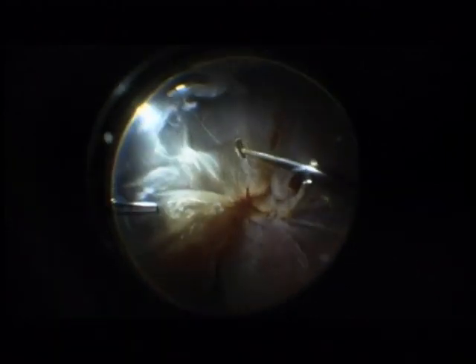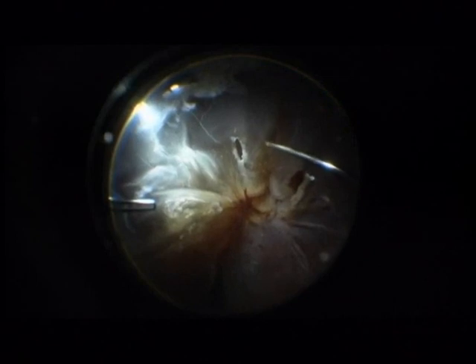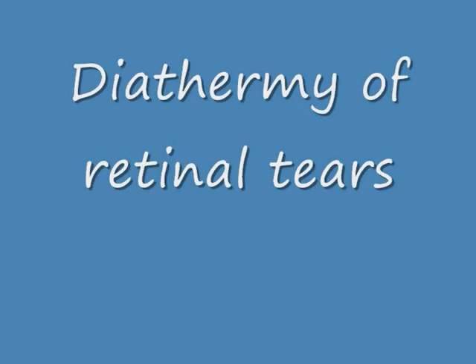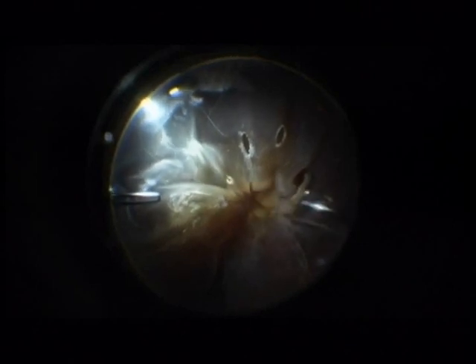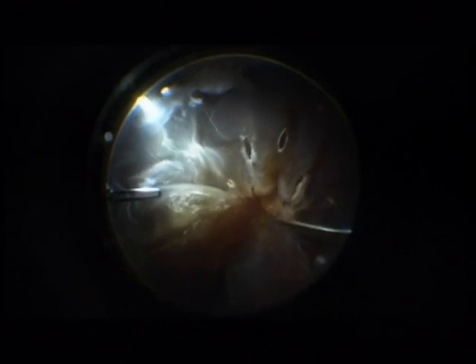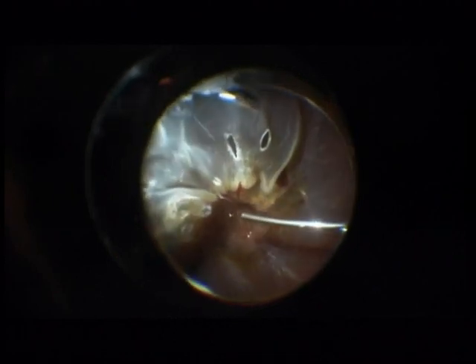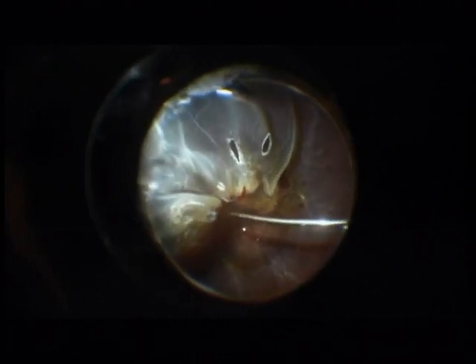Next step is diathermy of the retinal ruptures. The next important step is the injection of perfluocarbone to attach the retina.